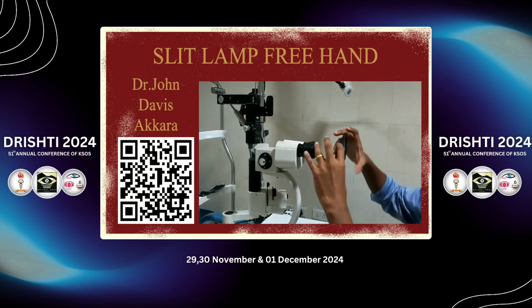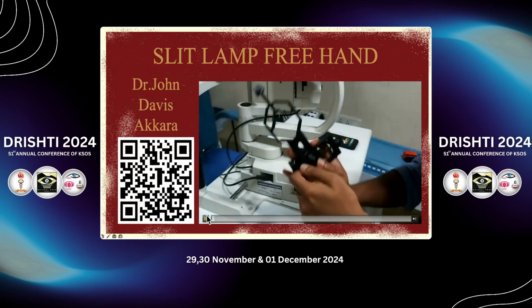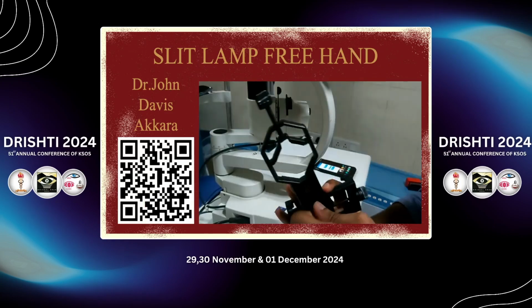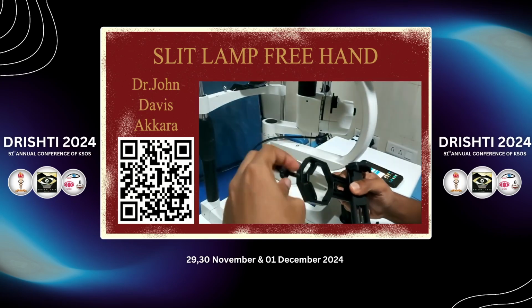An adapter, you can use that also. I suppose there is no sound for the video. No. So if you have the adapter, I think it's around 400-500 rupees on Amazon.